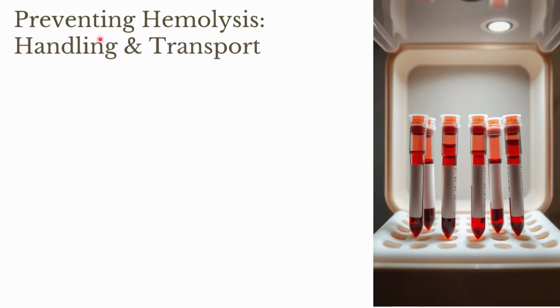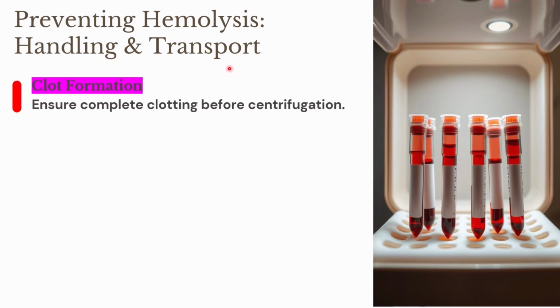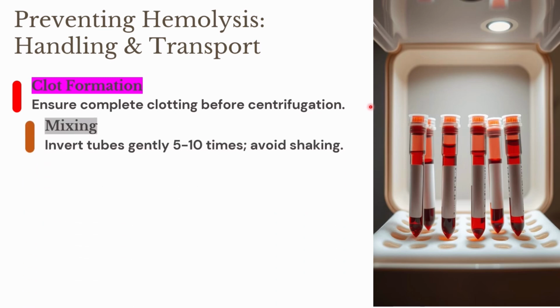Now coming to the prevention of hemolysis during handling of the samples and their transport. So first important factor which we should keep in mind is clot formation. We should allow the proper clotting of the samples before centrifugation. We should not be in a hurry to centrifuge the samples, because if the clot is not properly formed, then also hemolysis can occur during centrifugation.